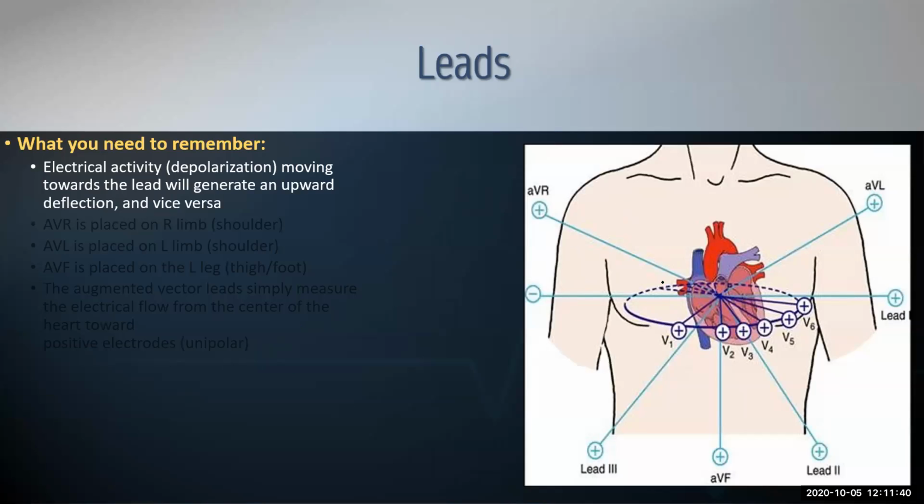So you should see a negative depolarization. Whereas if you're in lead 2 and it's down here in the bottom left, and I'll have another slide that helps visualize that, and it's seeing this electrical depolarization come downward, then you should expect that to be positive, because the electrical axis is coming towards it. This seems very archaic and basic, but I don't assume that everyone knows that. And I want to start with that because it's going to help understand everything from this point forward.